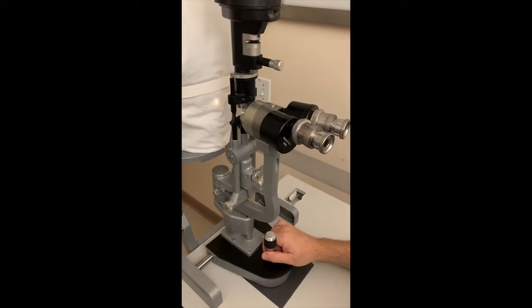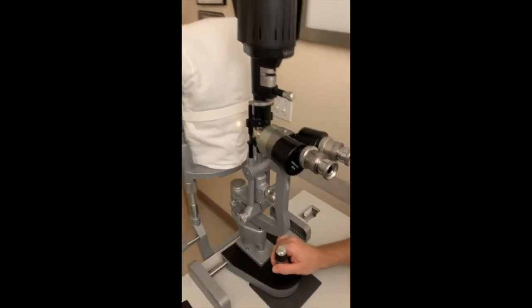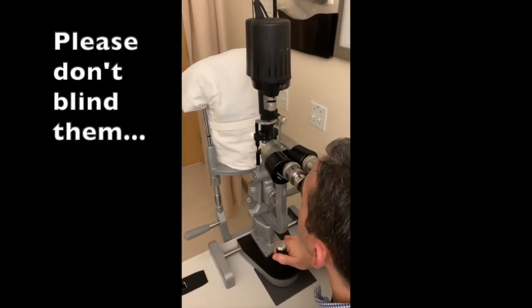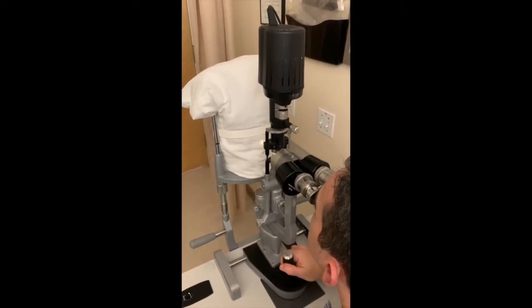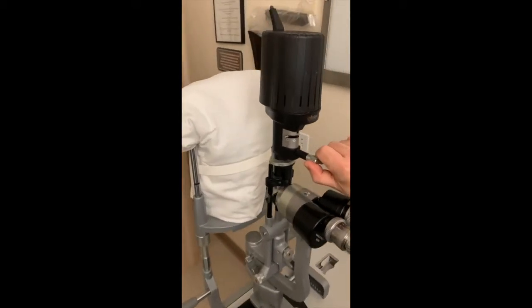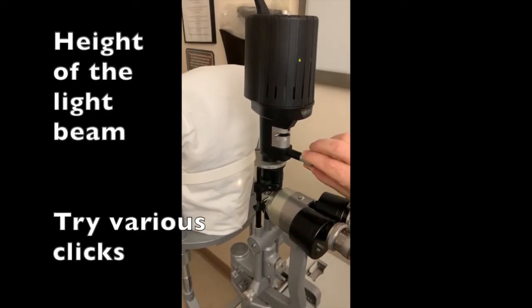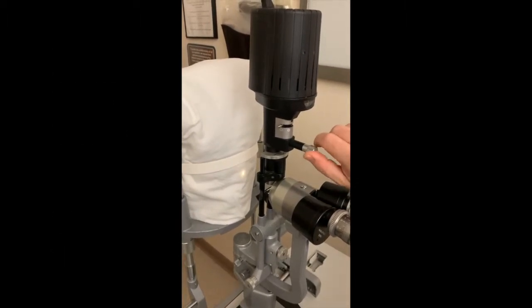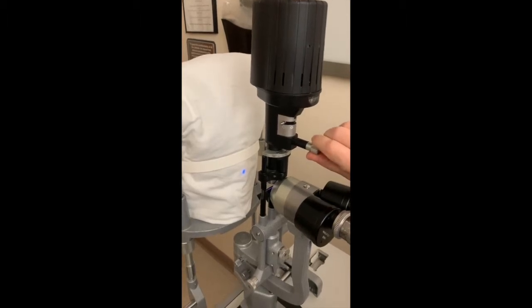The next step for me is usually I focus the light on their forehead or in between their eyes. You don't want to focus it in their eyes because then you'll blind them. So I focus it. Then I adjust the height of the light using this. And if I want my cobalt blue, I turn that to cobalt blue.